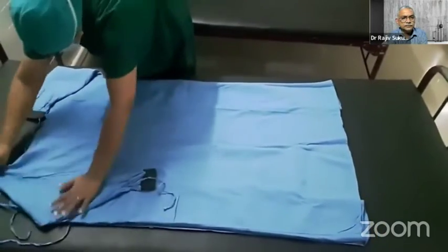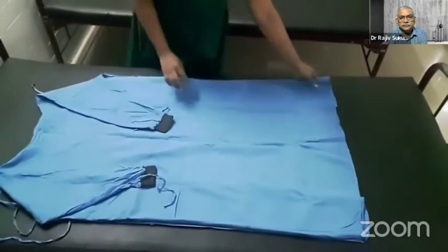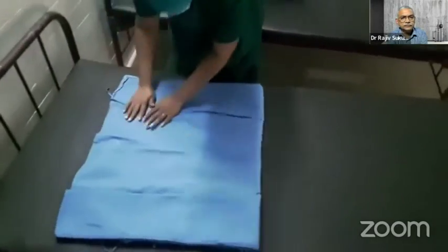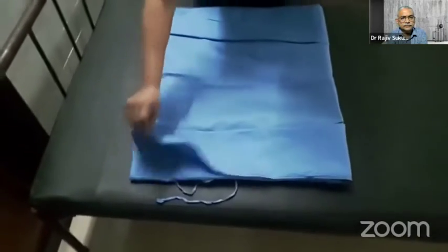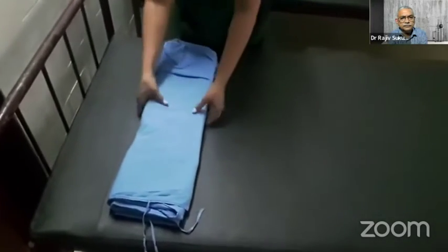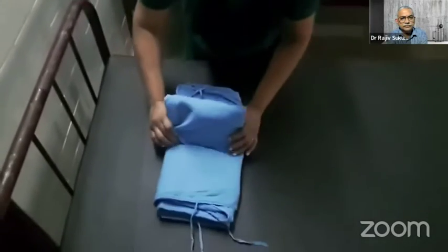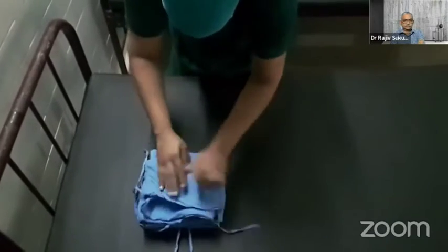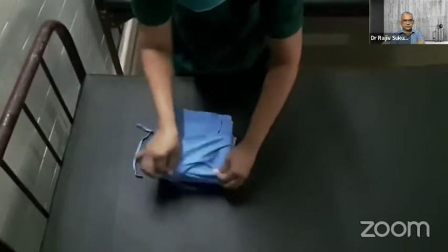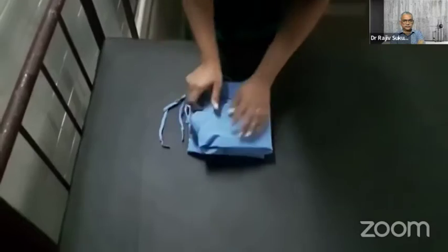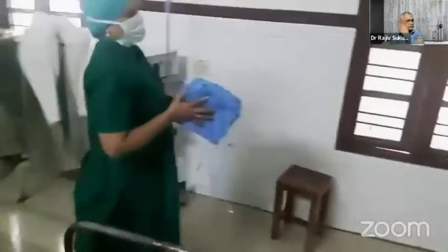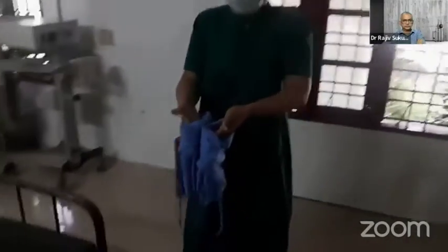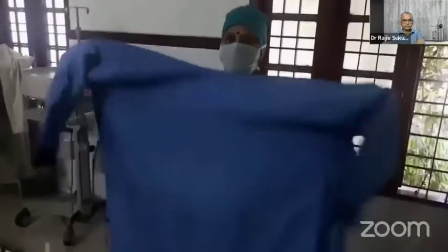This is the NMLF instrument draping method, used to introduce a sterile instrument or pack to a surgical site. If you want to introduce a handpiece to the surgical site, the person handing over opens it and follows the proper method of folding the gown. You fold the back fold into half on either side, then fold the arms to the front, then fold the entire thing into half, and again into three layers. Pull the middle part to make a W-like fold and fold it into four layers. You can tie it up with a tie so it does not open accidentally.